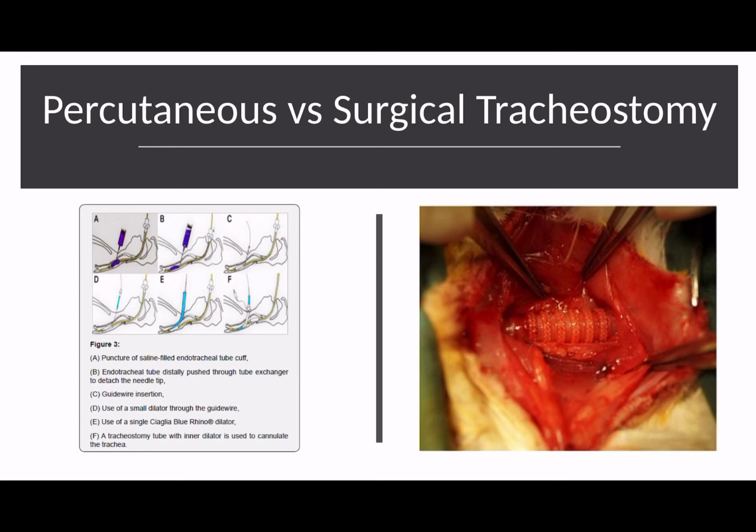And so usually for the first 2 weeks after a percutaneous tracheostomy has been put in, there is a high risk that tract could close up very quickly if you don't get another tracheostomy in. And also it can be quite difficult to get another tracheostomy in as soon as that comes out. So be very careful of patients with percutaneous tracheostomies for the first 2 weeks, some say up to 4 weeks.